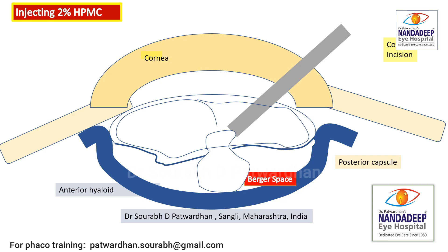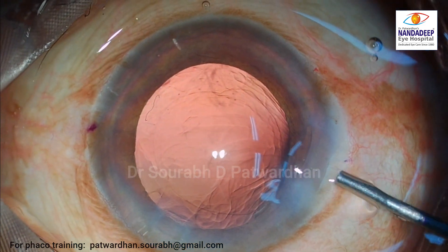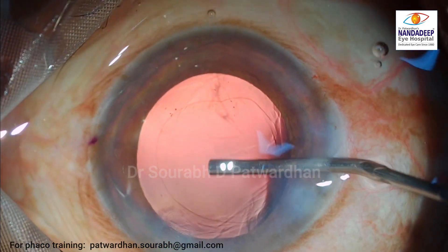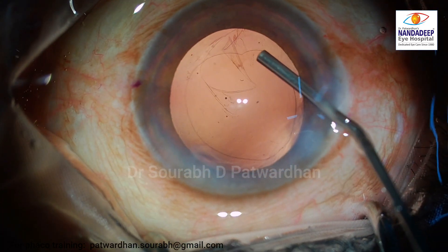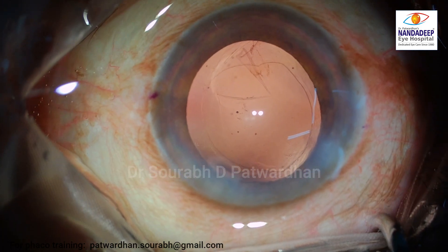Watch the visco movement carefully — how it goes beyond the posterior capsule. If it stays just beyond the posterior capsule, you know that the anterior hyaloid is intact. But if it goes into the vitreous cavity, that indicates the anterior hyaloid may be ruptured. Here, when the viscoelastic was injected, it is not going freely into the vitreous cavity but just stops beyond the posterior capsule — that indicates the anterior hyaloid is intact.